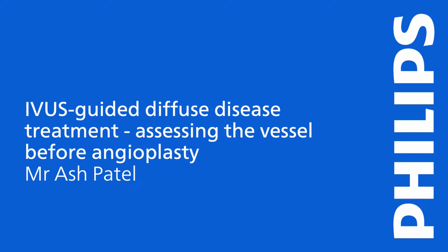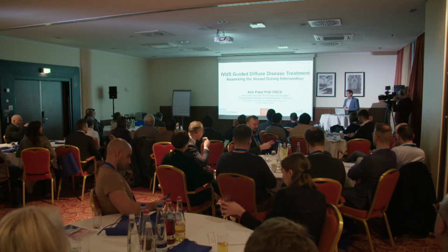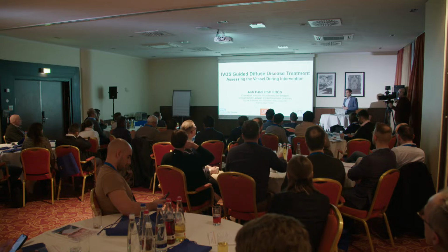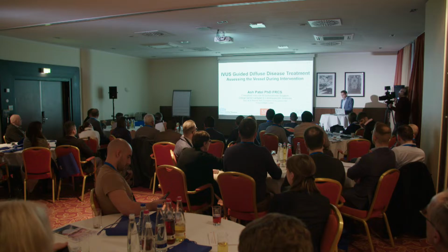Okay, shall we continue? I hope you're well refreshed. So the next session is going to be some more practical case examples. Please feel free to interrupt and ask questions. This is a very interactive session. This is about how to assess the vessel during your cases. And we'll go. So what happened there?